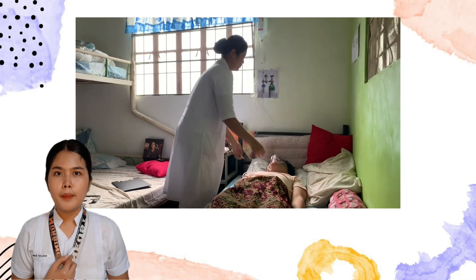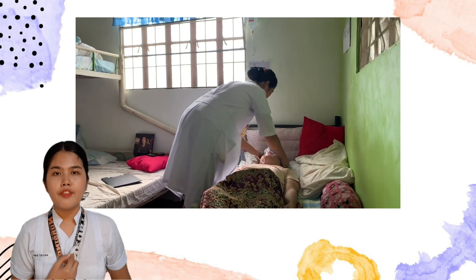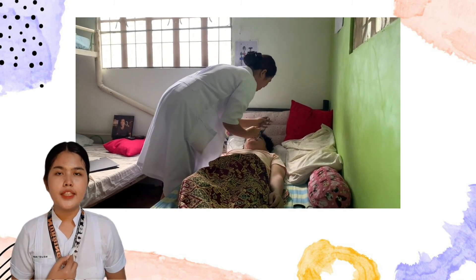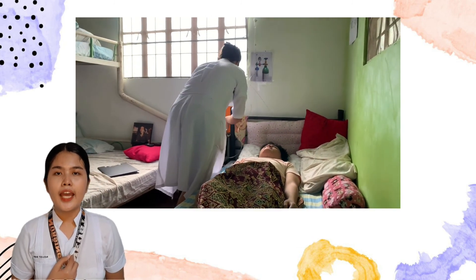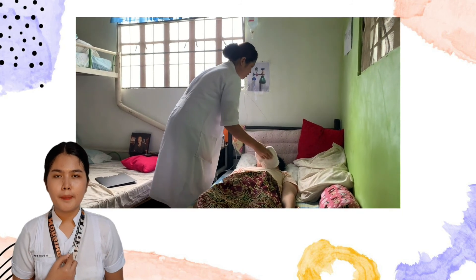Remove the mask and dry the skin every two to three hours if oxygen is used continuously, and do not use powder around the mask.